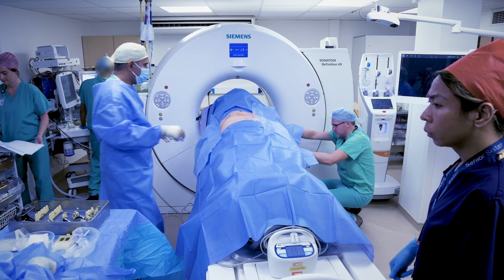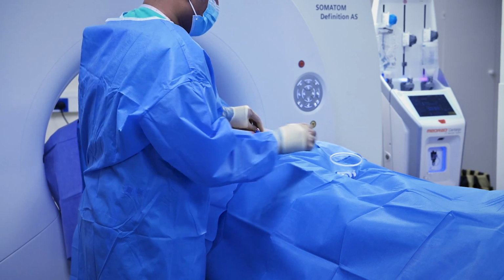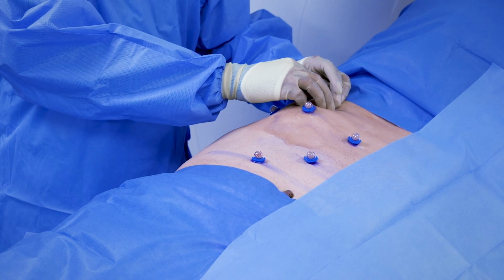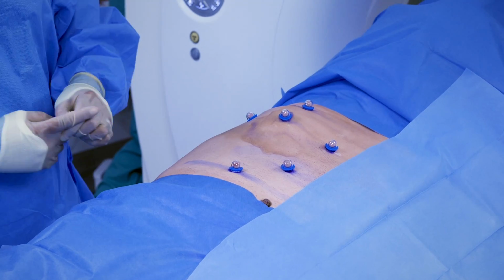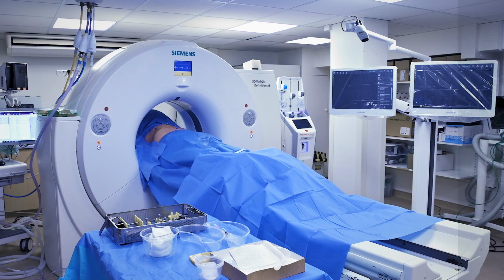Patient is now prepped and draped. Next step is to put the stereotactic markers, skin markers on. You don't always need to use all 6, but as best practice it would be best to try and get them all in view and visible. So we now have the 6 markers on, and the next step then will be to do a CT scan and see whether or not we can identify the tumour.